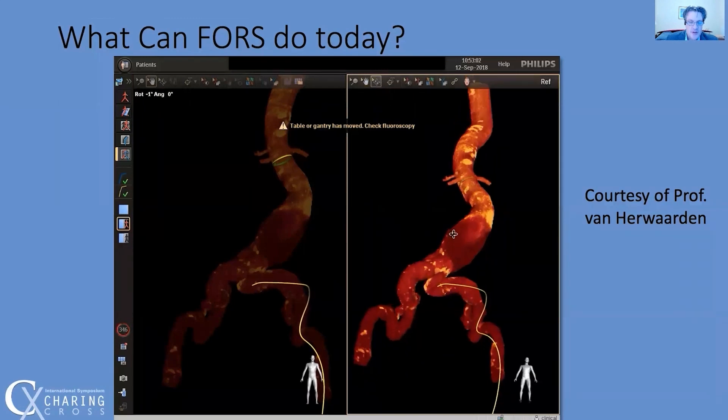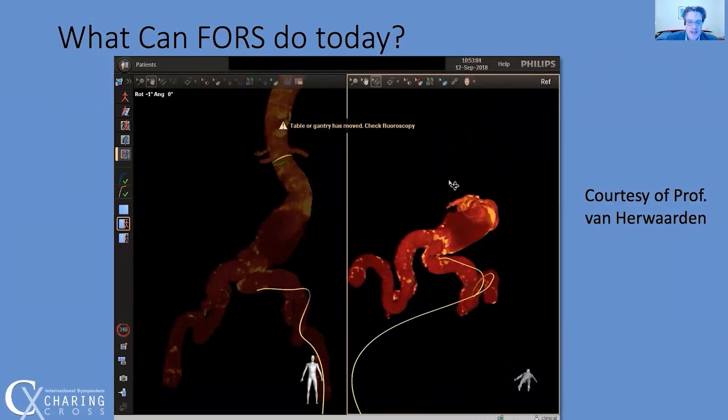Here, Joost van Hervarden used a viewing angle of almost 90 degrees of caudal to make cannulation of this tortuous iliac easier and safer. This is obviously a view that's not feasible with standard fluoro.